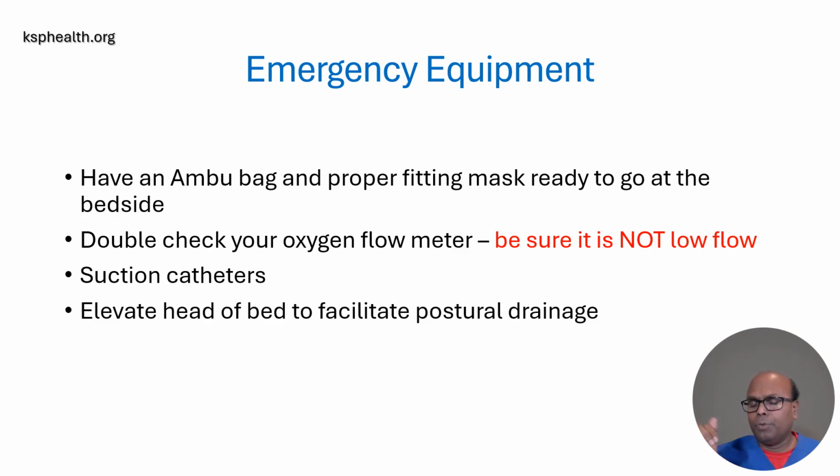In both conditions, whether you do RAM cannula or high flow nasal cannula ventilation, always have emergency equipment ready. Those are an ambu bag and a properly fitting mask ready to go at the bedside.